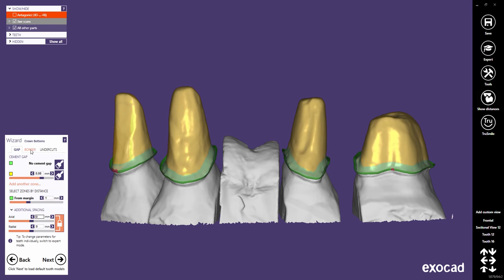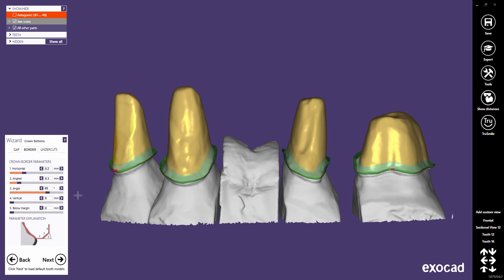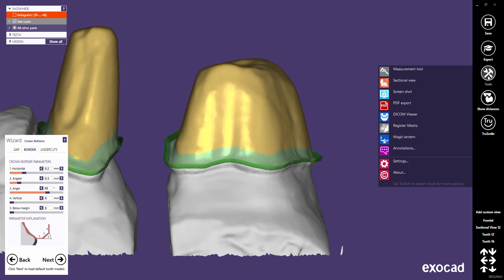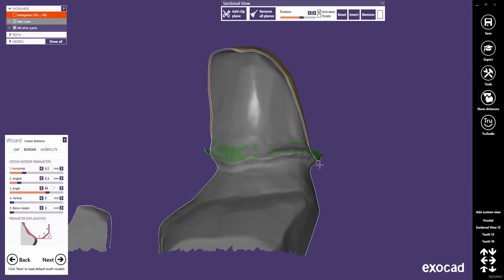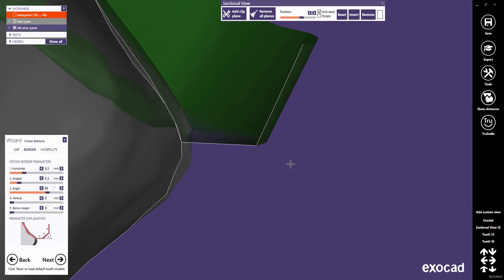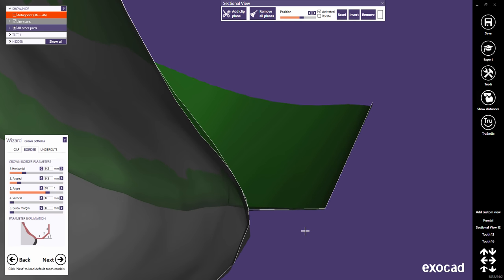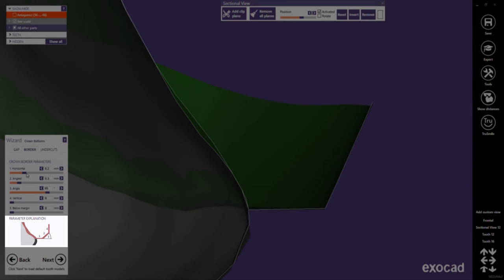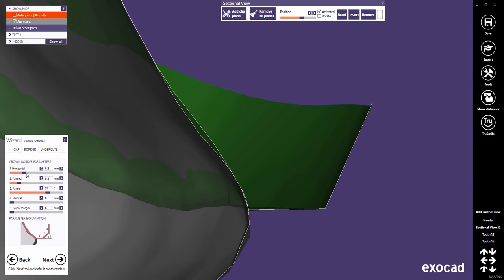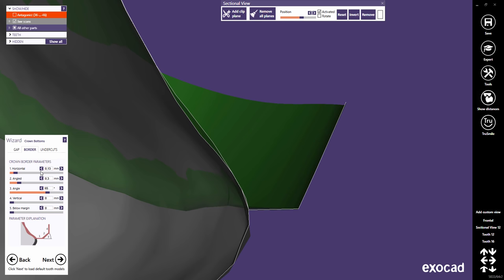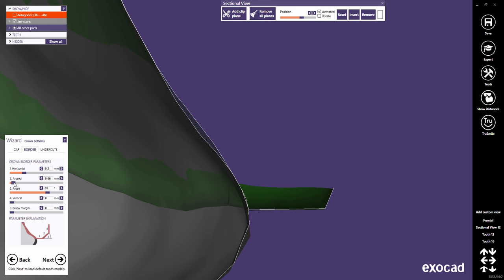Let's have a look at the border settings. A sectional view will help us understand how the border shape can be influenced. The graphic illustrates the meaning of the sliders. Horizontal defines the horizontal crown border width — typically, material properties enforce certain limits here; for zirconia, the common minimum value is 0.2 mm. Angled defines the length of the border's angled part, commonly set to 0 for metal.